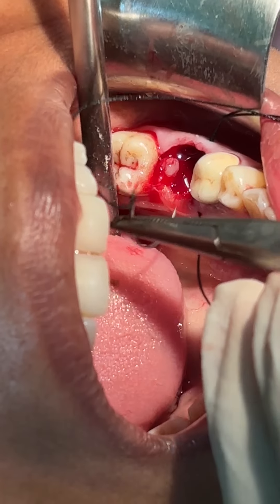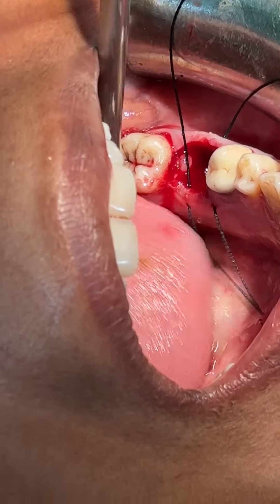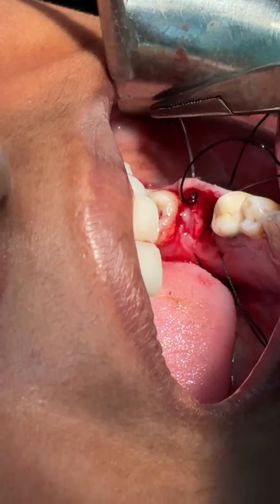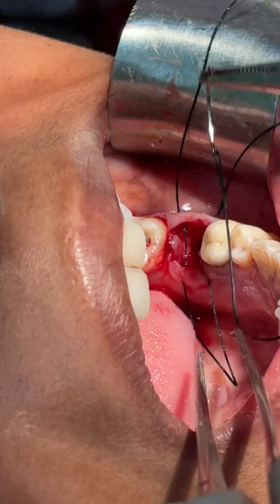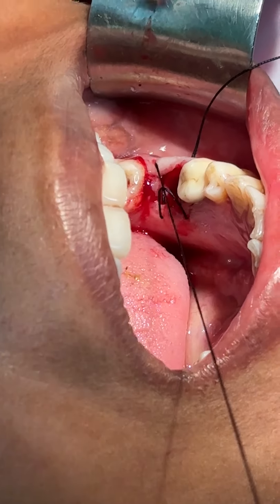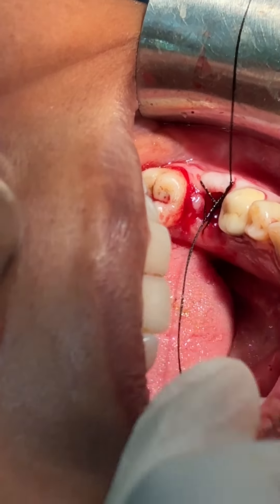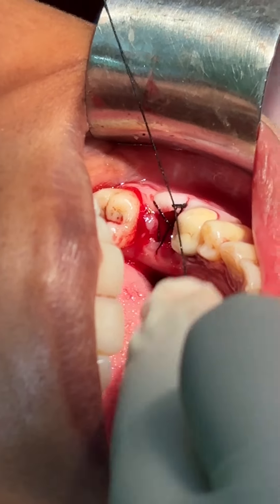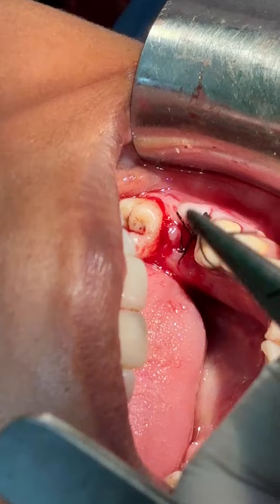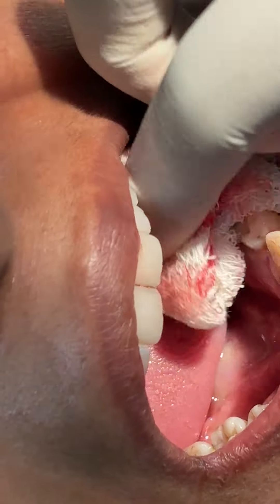Again, the third bite will be on the lingual mucosa, and the fourth one will be on the buccal mucosa. Now I will pass this needle through this loop — you can see. I will tighten the suture. You can see how nicely the flaps are coming together. In implant with bone grafting, we can use this type of suture — it is very nice for control of bleeding and closure of the socket. Now we will just close it. That is how we can do the extraction and the closure of the socket.